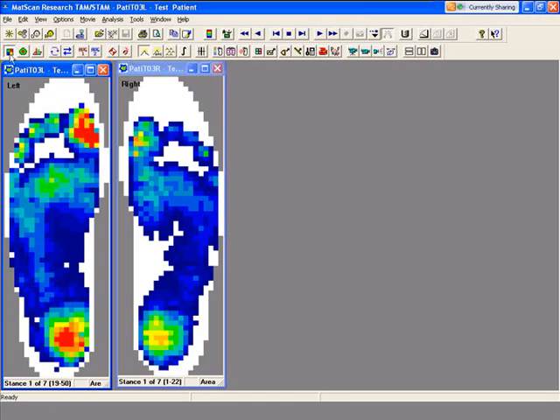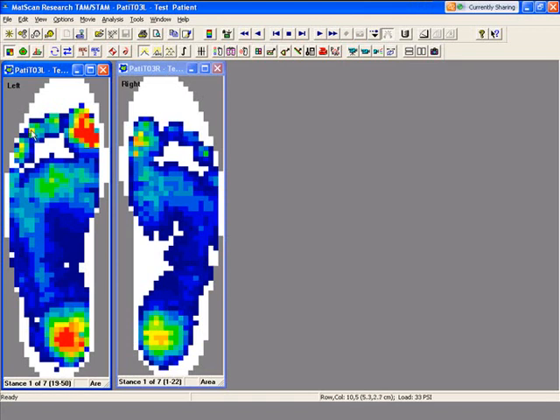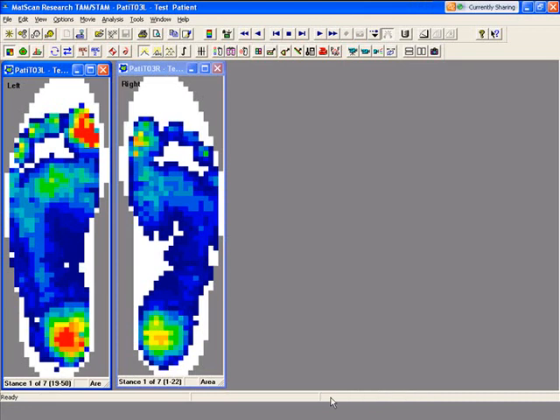The first icon we're going to look at is the 2D icon. The 2D icon is the actual raw output of the sensor, so you can see each one of the sensing cells is represented by an individual square. You can actually find the exact sensing cell by placing your cursor over that area.